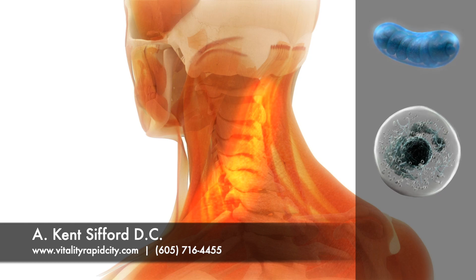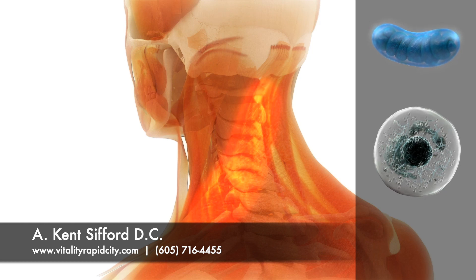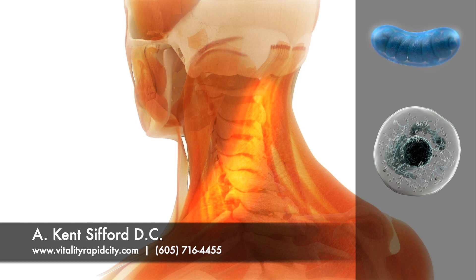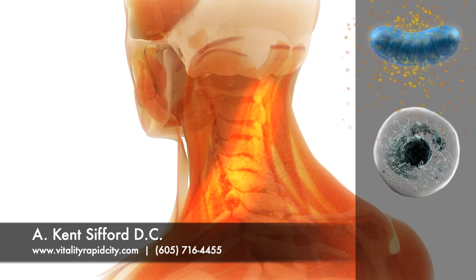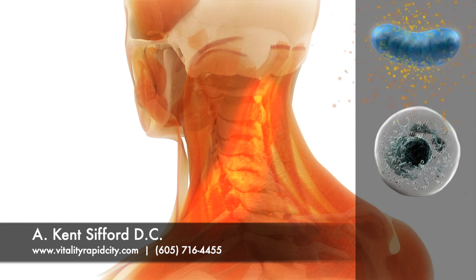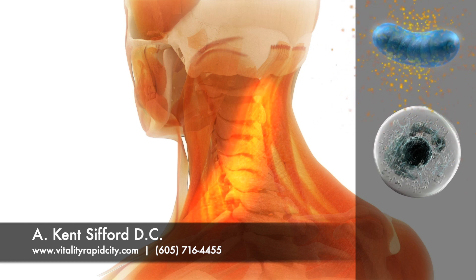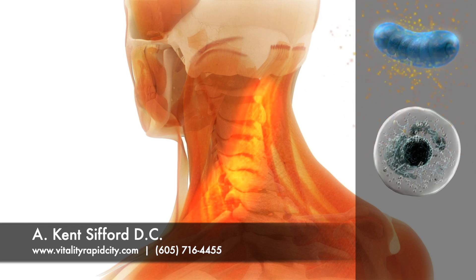The Erchonia low-level laser is proven by research to help the mitochondria make energy by a process called photobiology, thereby speeding the healing process.